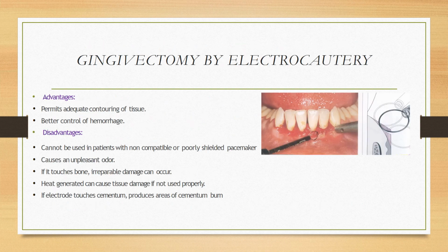Coming to gingivectomy by electrocautery, this also has become outdated. As you know, the trend now is the laser gingivectomy compared to electrocautery. If you talk about the advantages of gingivectomy by electrocautery, it permits adequate contouring of tissue and better control of hemorrhage.